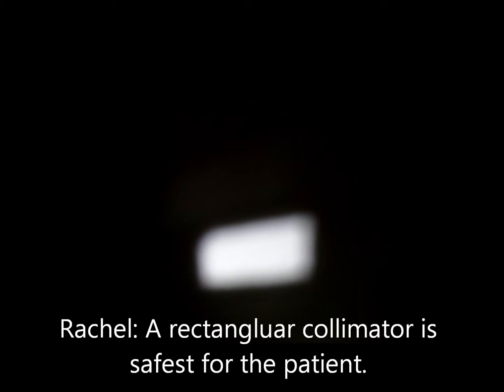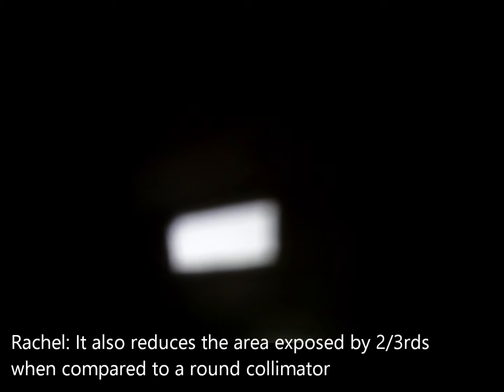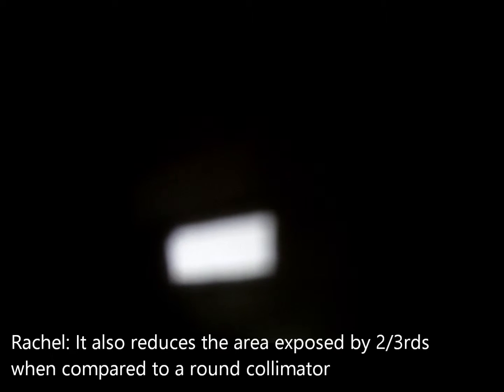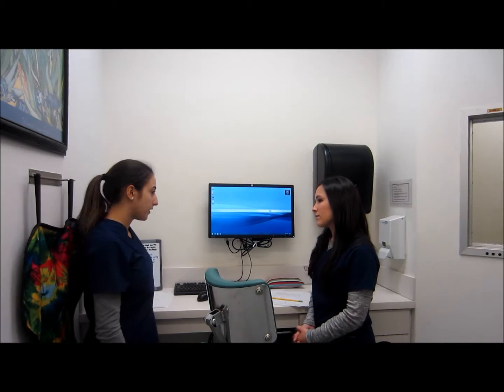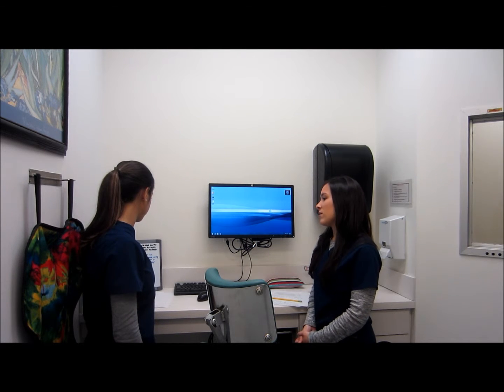A rectangular collimator is the safest for the patient. This type of collimator lines up with the size of the film, producing a clearer image. It also reduces the area exposed by 2/3 when compared to a round collimator. Did you understand how the collimator affects the beam size with the flashlight? Yes, but maybe we should actually expose using the collimators to get a better idea of how they work.